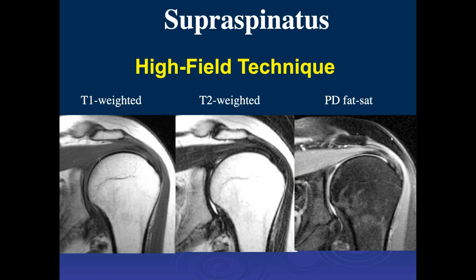On T1 weighted images, the fat within the bones is bright with black cortical margins and gray signal intensity within the soft tissues. On T2, the muscle is a little darker than on T1, while fat continues bright with fast spin echo T2. With PD fat sat, muscle is brighter, tendons stay low in signal intensity, fat is suppressed within the bones, and this highlights a lot of soft tissues. PD fat sat is sensitive for edema syndromes both within bone and soft tissues.